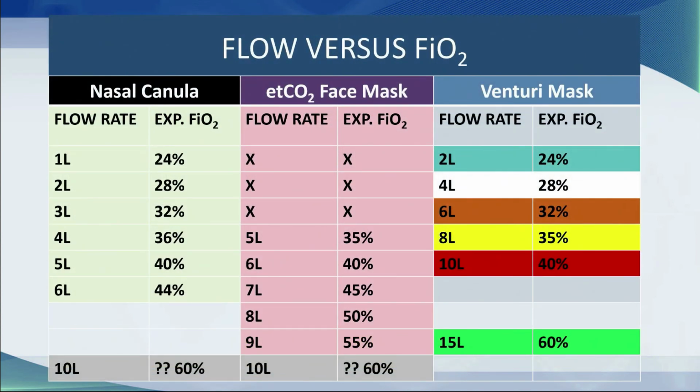It's really difficult to give somebody 30% oxygen through the devices that we've already discussed. Unless you give 2.5 liters, for example, through a nasal cannula, really it's quite tricky. There isn't a specific Venturi that's provided that does 30%. And so it's much more likely that Trish was receiving oxygen through a high flow device that we'll discuss in a future tutorial. With respect to Jesse, for him to get 50% oxygen, it's likely that he received 8 liters through a face mask or indeed a high flow device.